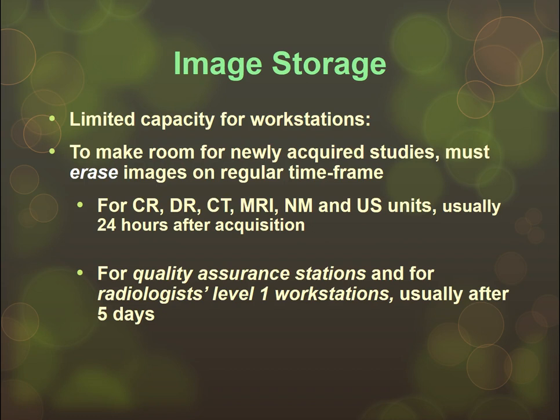Image storage. There's limited capacity for workstations, right? So when you bring a study down, when you pull a study from PACS, it gets cached locally on the hard drive of your workstation. And that makes it easy to look at and view and manipulate. You're not having to do that over the connection to the PACS server. It just sends it down, and all that manipulation that we talked about a moment ago with DICOM functions happens with the computing power of the PC. So to make room for newly acquired studies, these things have to be erased.